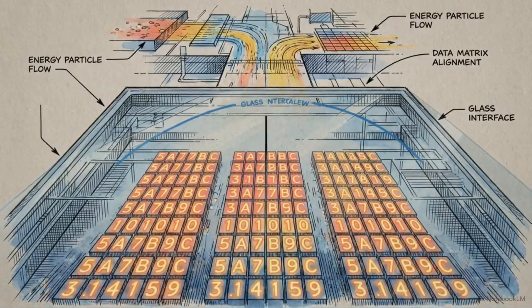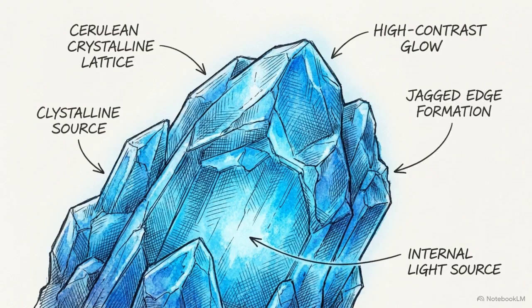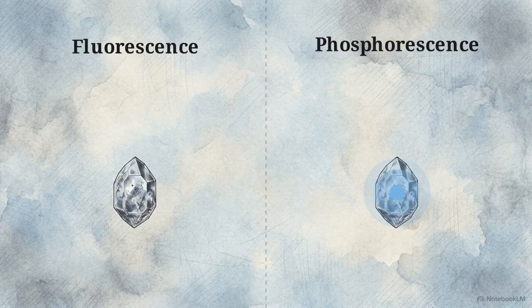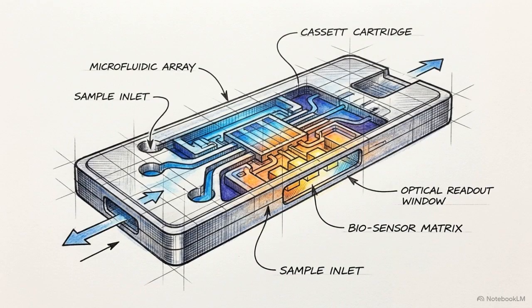Digital radiography comprises three distinct physical methodologies, each offering a different technical pathway for translating human anatomy into a permanent numerical grid. When X-ray energy hits a phosphor screen, it converts into light through X-ray luminescence. This happens via two mechanisms: fluorescence, which is the immediate emission of light, and phosphorescence, where the emission of light is significantly delayed. Computed radiography, or CR, relies strictly on phosphorescence. It exploits this delay to temporarily store energy in physical space.